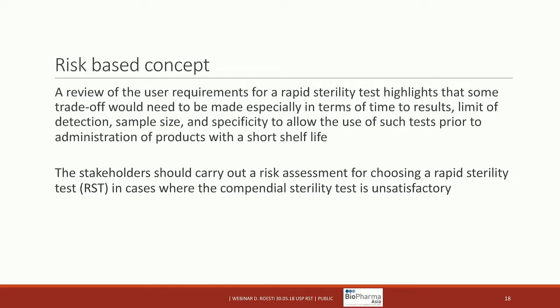So there's not a perfect method on the market at the moment, not one fit for all. You don't really have a method with very high sensitivity and almost immediate results. That's almost impossible. Only in very rare cases can you apply this, but in most cases you cannot. So you always have a certain weakness in the model that you're going to use, but sometimes that might not be relevant to what you want to demonstrate.